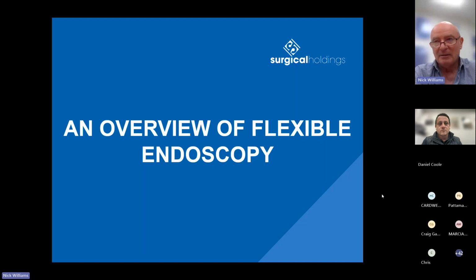But the main stimulus for development was actually Japanese gastric cancer many years ago, and the first developments were what was termed a gastrocamera, which is basically a camera which you literally swallowed, with a lens at the bottom that took the pictures. That then developed into using fiber optic technology to get the image back, and then onto video. So it evolved in a series of steps.